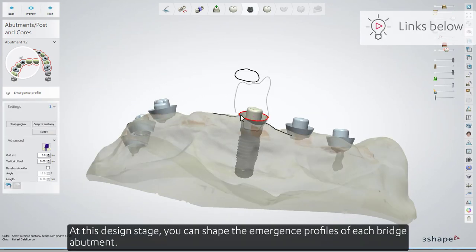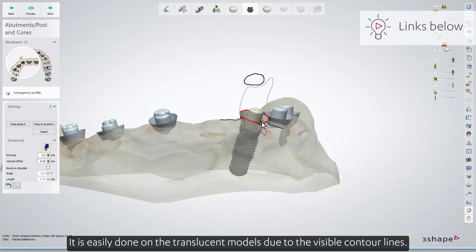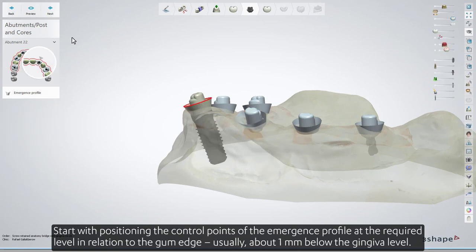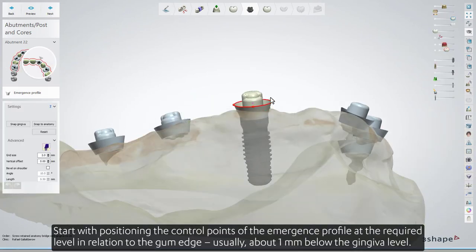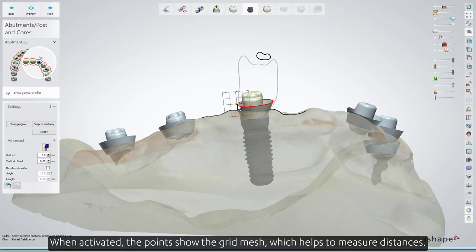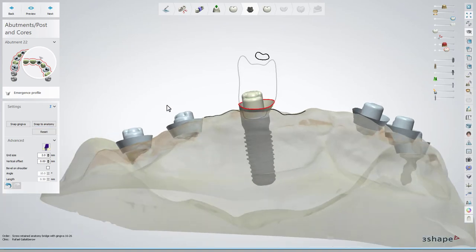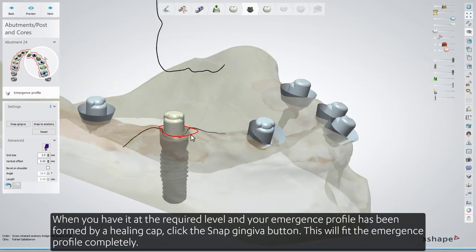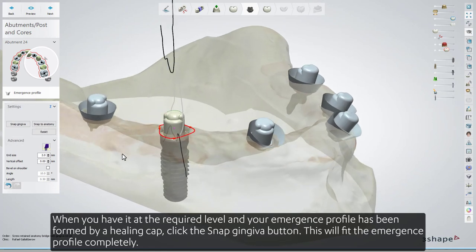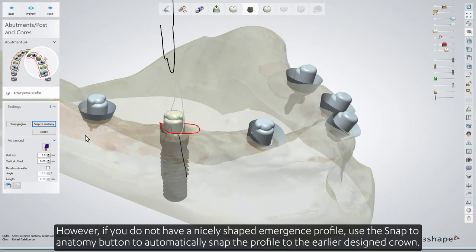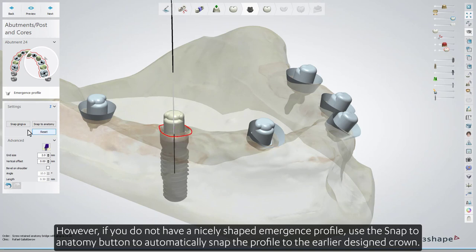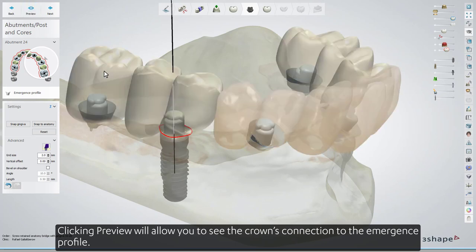At this design stage, you can shape the emergence profiles of each bridge abutment. It is easily done on the translucent models due to the visible contour lines. Start with positioning the control points of the emergence profile at the required level in relation to the gum edge, usually about 1 mm below the gingiva level. When activated, the points show the grid mesh, which helps to measure distances. When you have it at the required level and your emergence profile has been formed by a healing cap, click the Snap Gingiva button to fit the emergence profile completely. However, if you do not have a nicely shaped emergence profile, use the Snap to Anatomy button to automatically snap the profile to the earlier designed crown. Clicking Preview will allow you to see the crown's connection to the emergence profile.